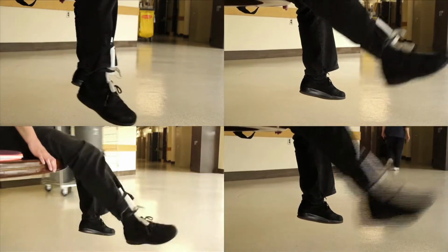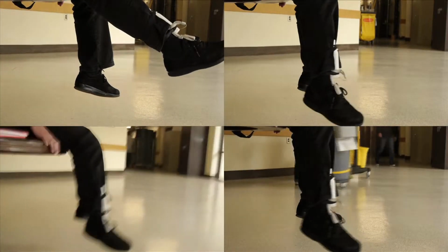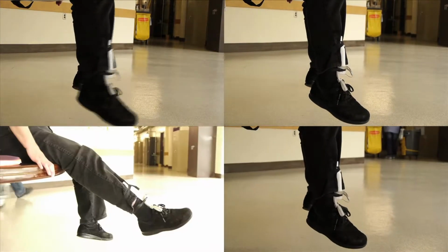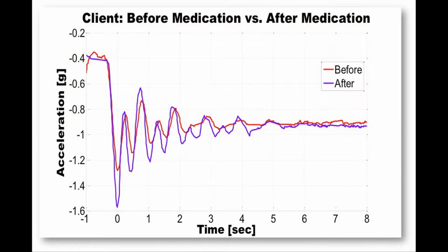We recorded our client's pendulum test constantly over the quarter while trying to keep the time and location consistent. From these tests, we were able to prove that the accelerometer is sensitive enough to detect a difference in degree of spasticity before and after receiving medication. As you can see on this graph, the purple curve represents her pendulum test after medication, which shows that her leg is swinging more freely.